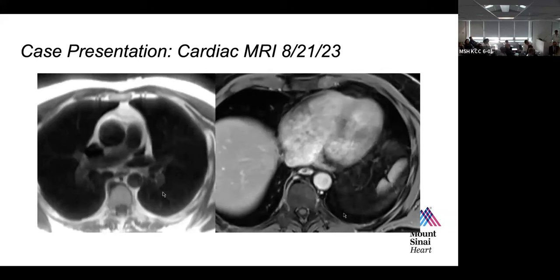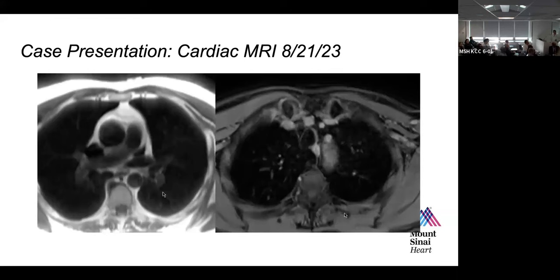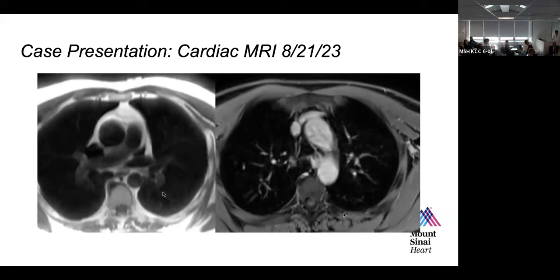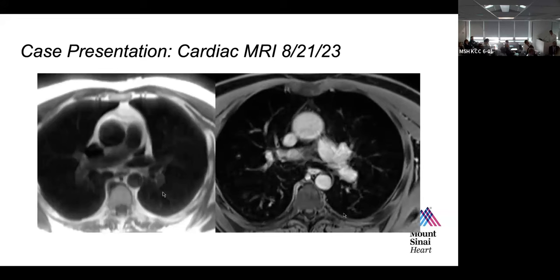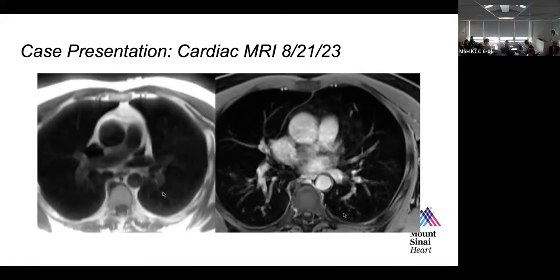Now, these 3D sequences are great to see vascular structures, but for the actual defect, we probably would have obtained that same axial sweep or axial stack in a cine, 5 to 6 millimeters, and in a sagittal, 5 to 6 millimeters.